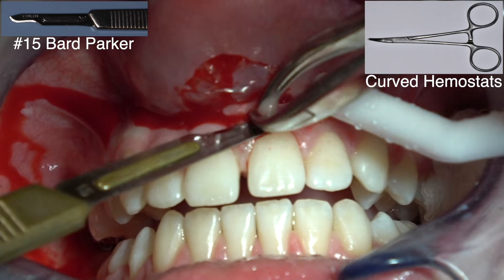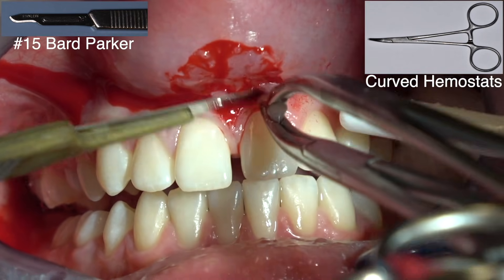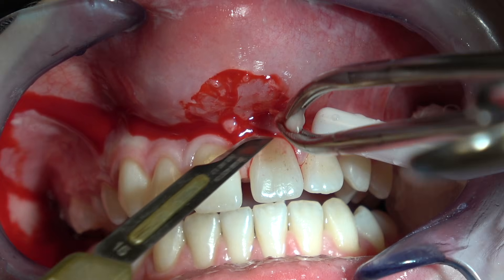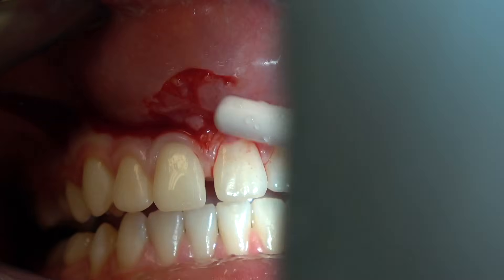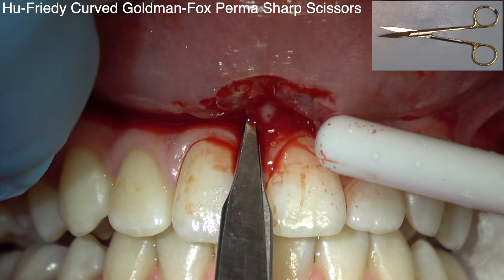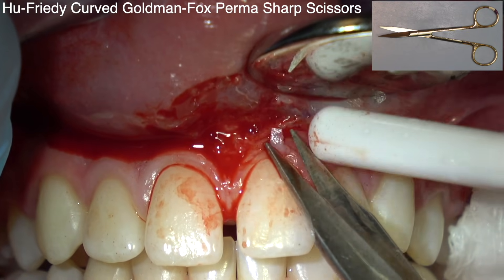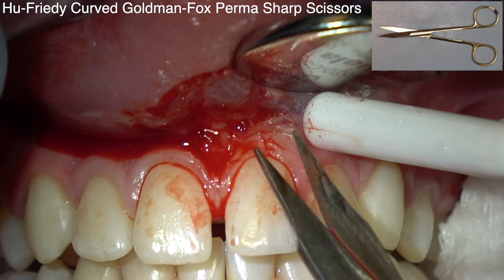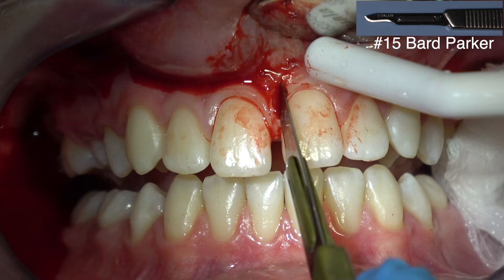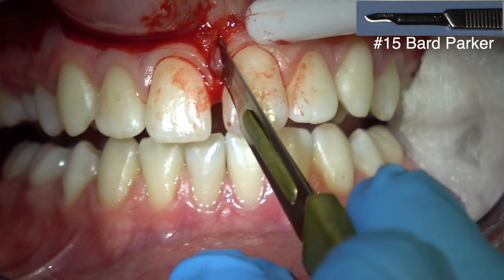You're going to remove this piece, which is the frenum, and then clean up any of the tags — just little tags that are remaining. Then you're going to make a V in this attached keratinized gingiva between the teeth. Make a deep V cut between the central incisors.